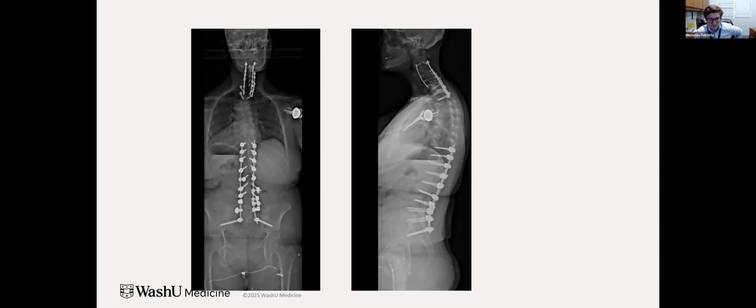Maybe slightly. I think the plan here was a little bit more challenging in trying to figure out what her limits of horizontal gaze were going to be. I will say again, however, she's happy with how she's standing. So despite a bit of pelvic retroversion, I think this patient's still very happy and pretty much functioning as normally as she could be at this point, and basically pain-free. So again, happy with that.